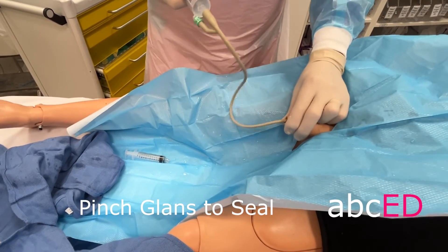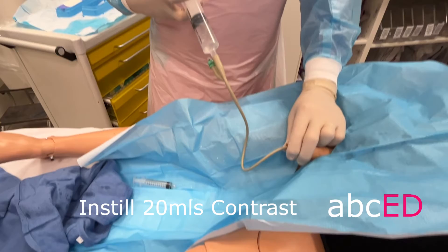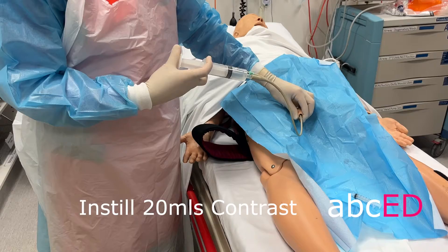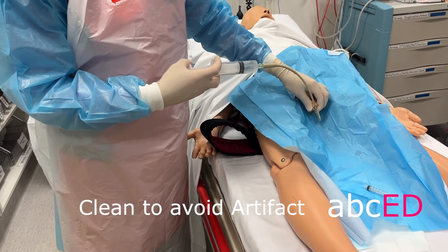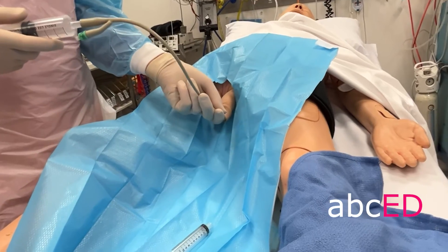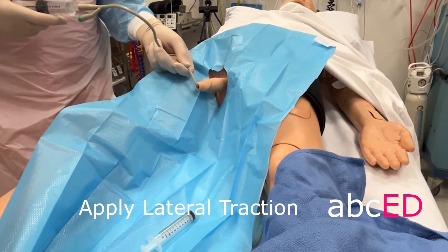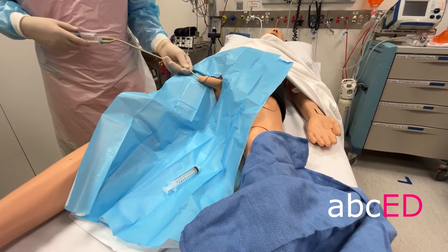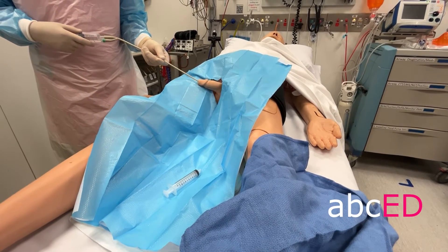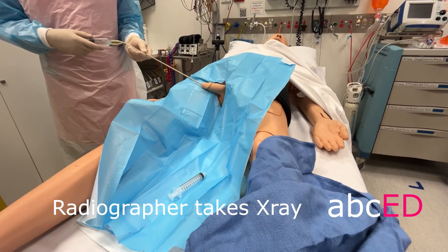Pinching the glans to create a tight seal, slowly instill 20 mils of contrast. Be careful to mop up any leaks to avoid artifacts on the x-ray. Apply gentle traction to the catheter laterally to move the penis into an oblique plane. Move your hand out of the way and take the x-ray.